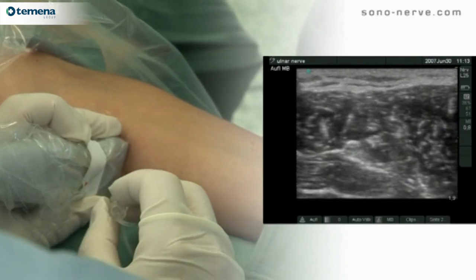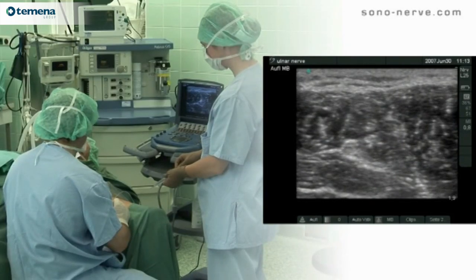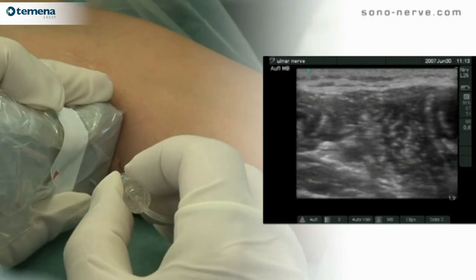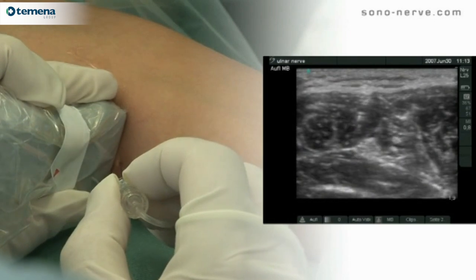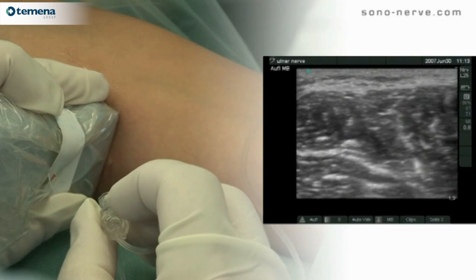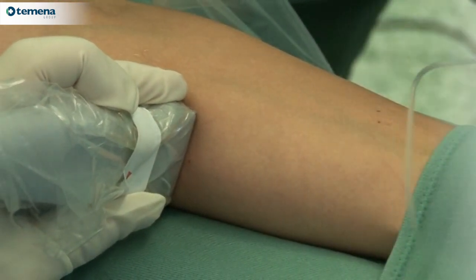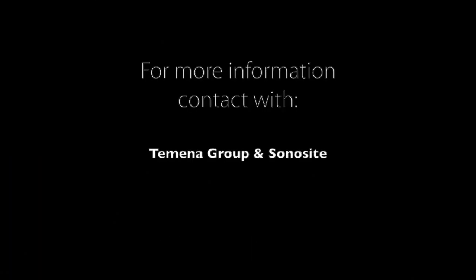Once the injection is performed, the nerve is shown clearly highlighted by the surrounding local anesthetic. It's worth noting in this very high quality picture the honeycombed appearance of the ulnar nerve.